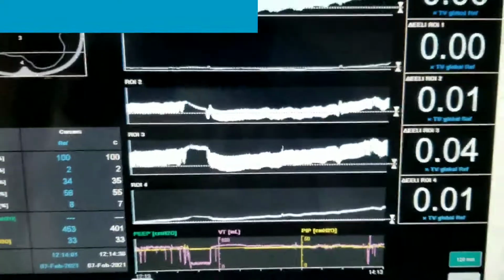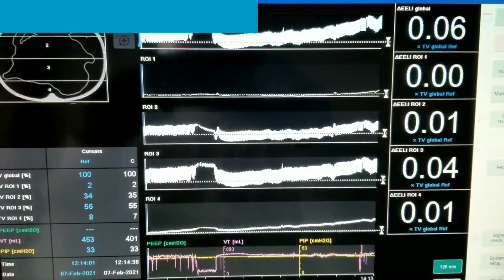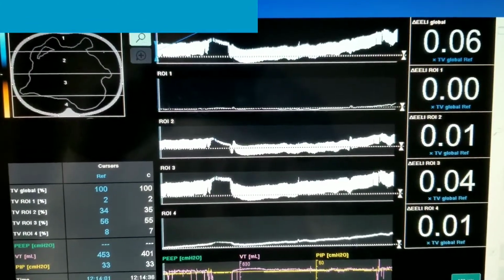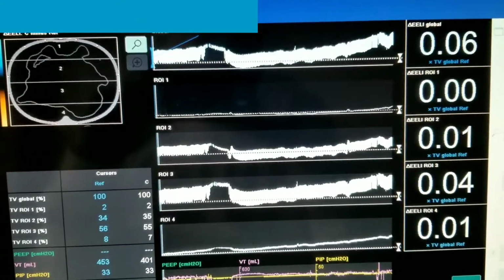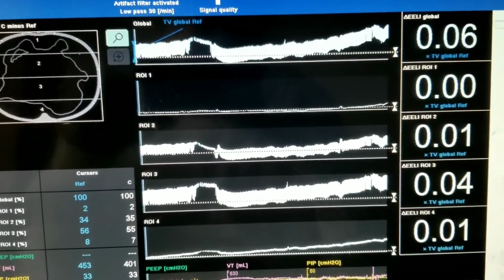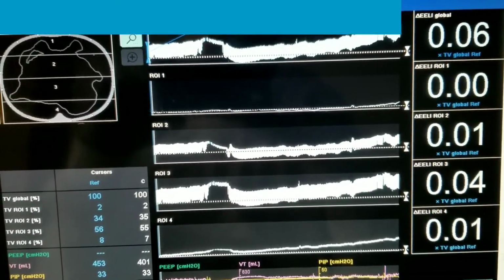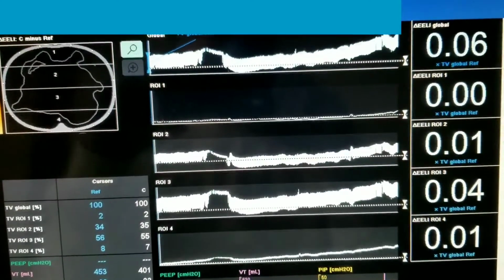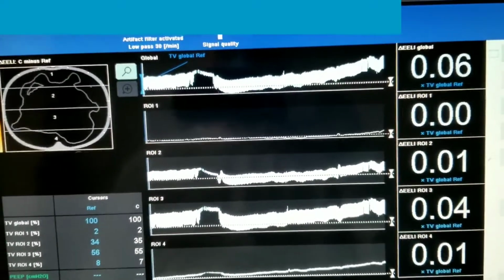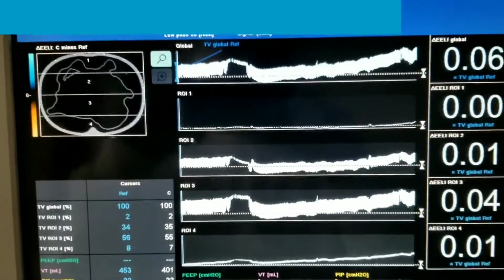So again, my assumption is I want to make sure that the P high level is not too high, where we're reaching a less compliant area on the pressure volume loop. As you know, we typically use global values on the vent, and let's say on pressure control we have a volume of 350. We go up in the units and we see that there's no great increase in tidal volume. We can assume that we're just adding more pressure with no distension, no improvement in tidal volume.